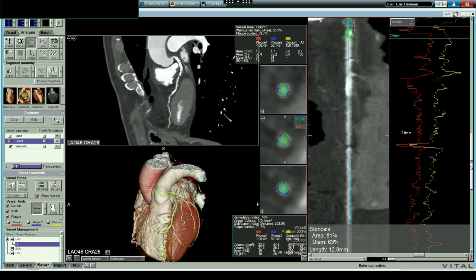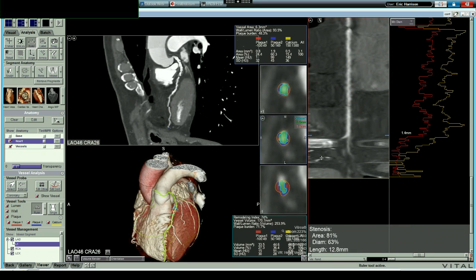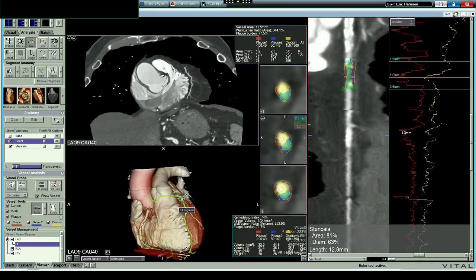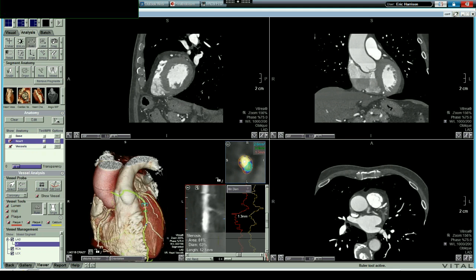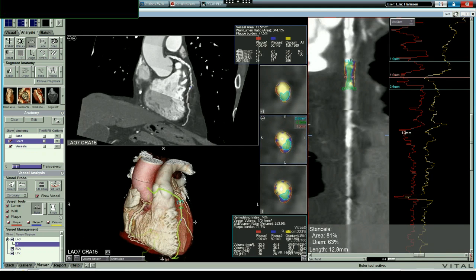And so we're going to go down further this vessel. There's some more down there, so I guess we're close to the end. So that's pretty much what we have. So it's a large amount of muscle that's being subtended by this, and it's right between the two diagonal vessels to locate where we are in terms of trying to figure out how much myocardium is exposed to this.